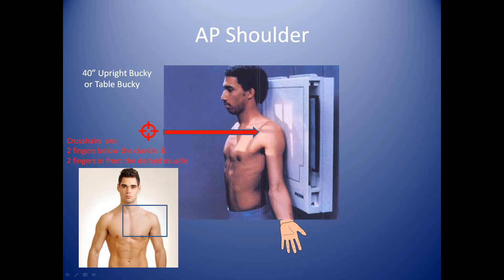For the AP view of the shoulder, we will be demonstrating this on the upright bucky. This is largely because it is a much faster workflow and more simple for the technologist and the patient. It is entirely possible to do this on the table — both tabletop and at the table bucky — but your workflow is much quicker and it's easier on the patient, so here we are at the upright bucky.